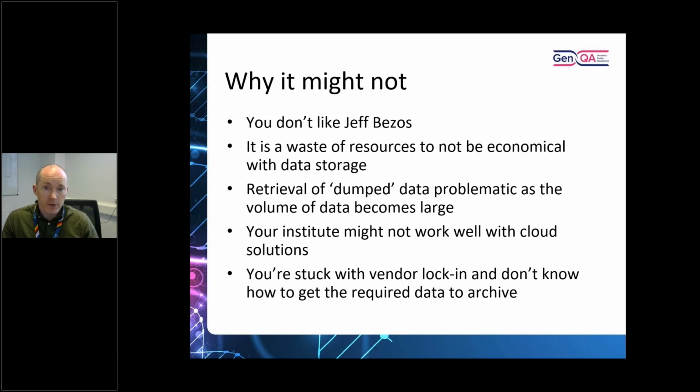So if you have to do a retrospective audit for whatever reason, something you suspect in a pipeline, it might take a year to churn through the data, and it will cost you an absolute fortune. Whereas really you should be saying, okay, I'm going to be judicious about this. And if you did that with wet lab analysis, that's what you would do. You would say, I'm going to take a representative section, look at that, and see how that fares out. So it can become problematic.